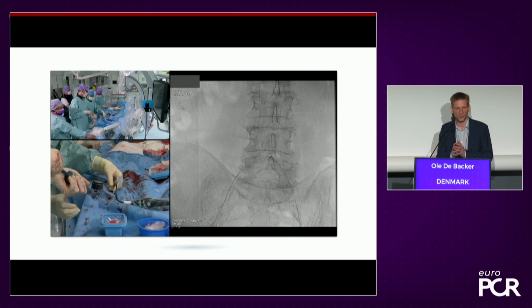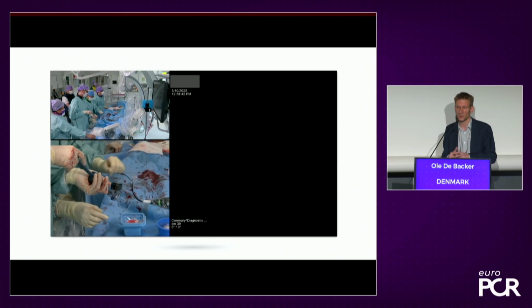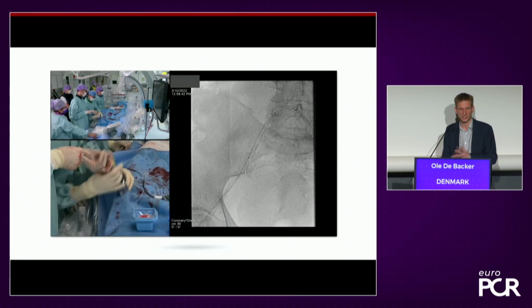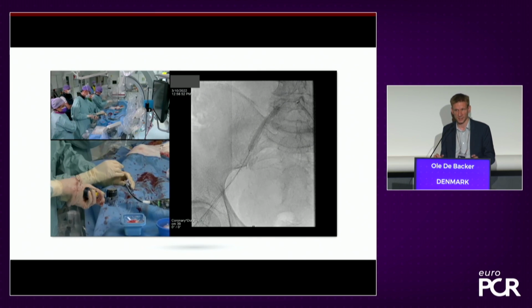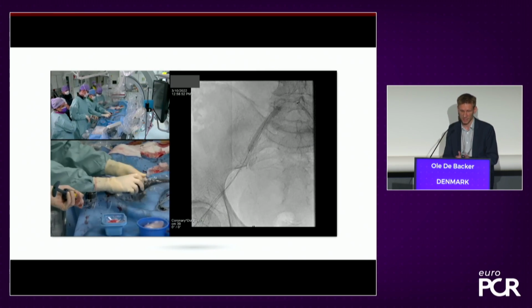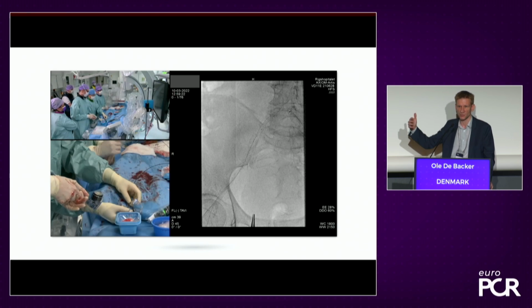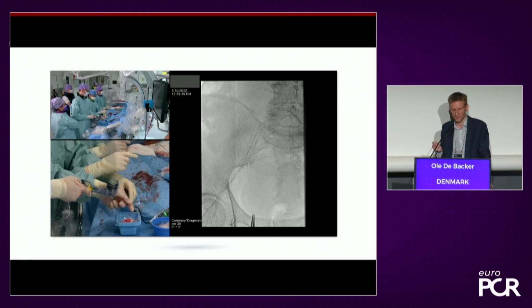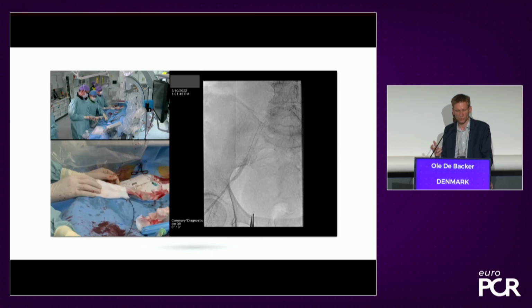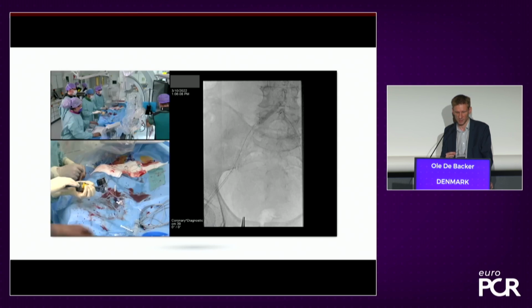It's not so much that I anticipate problems at the IVL-treated part; that I almost never saw. Only 1 out of 60 cases had a spiral dissection, but in 59 out of 60 it was completely successful and without any complication. It's more because you're concerned about the puncture site, and that has nothing to do with your IVL-treated part. These patients also have a calcified or nasty puncture site, and then you have more risk of vascular closure failure. So it's more to catch up on these complications that in these particular cases I like to use a safety wire sometimes.